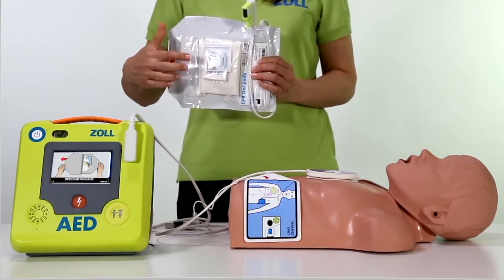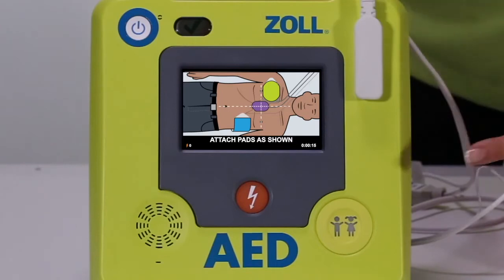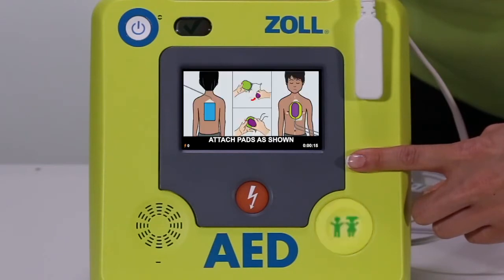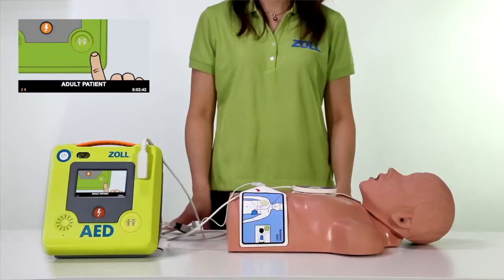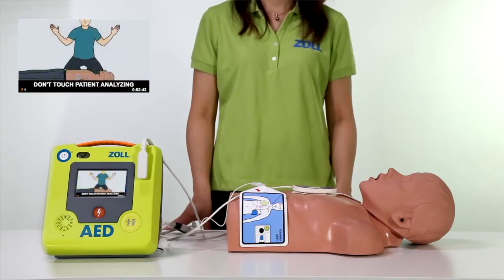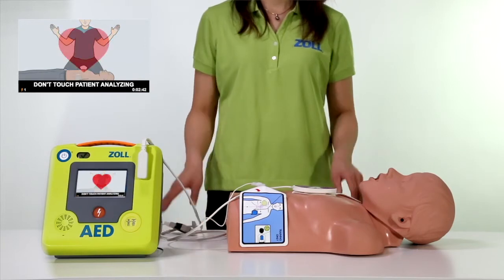Open the pad package and attach pads to the patient's bare chest. Matching screen and pad graphics show proper pad placement for adults or children. The color screen graphics and CPR landmark on the pads provide guidance on proper hand placement.